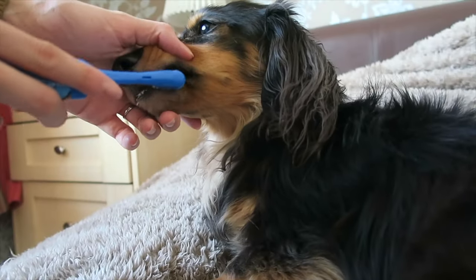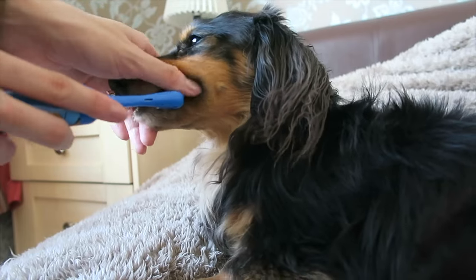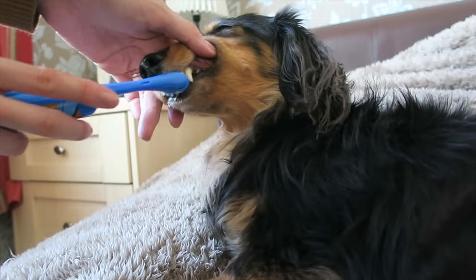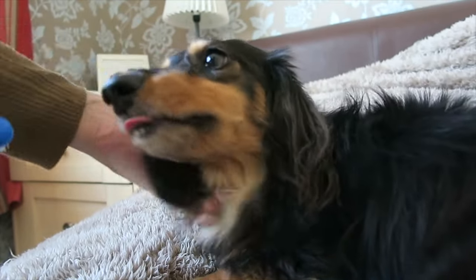Once you have scaled your dog's teeth, go and get a toothbrush and some toothpaste and give them a good toothbrush just to massage the gums a little bit more and get any excess tartar and plaque that is left on the teeth off with that toothbrush as well.